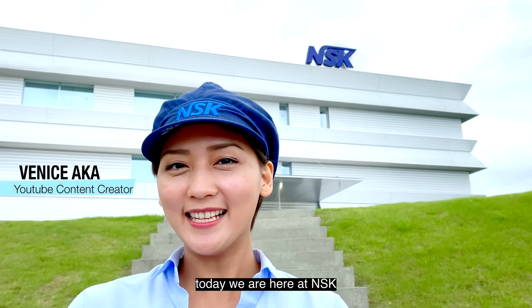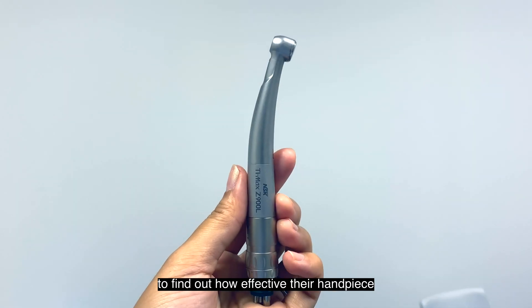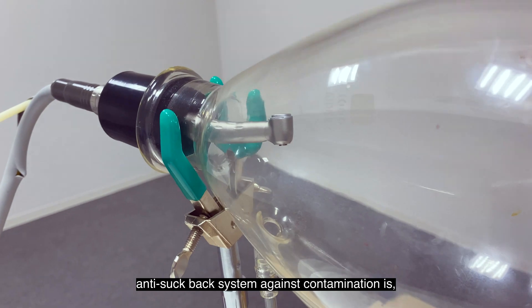Hi everyone! Today we are here at NSK to find out how effective their handpiece anti-suckback system against contamination is compared to other brands.